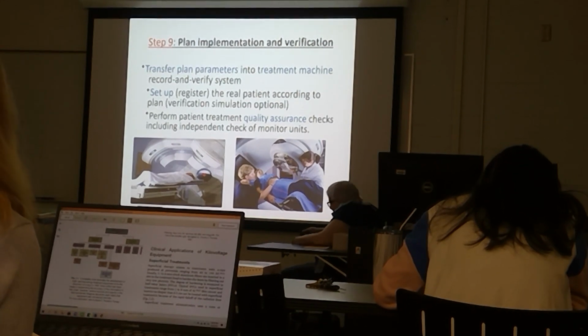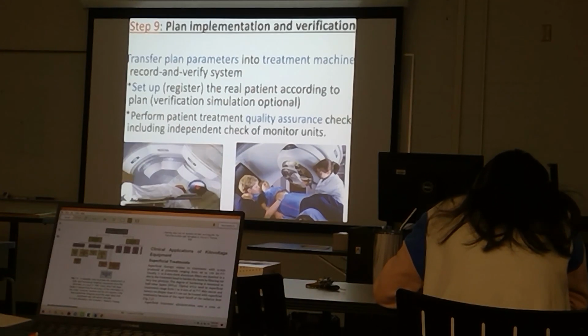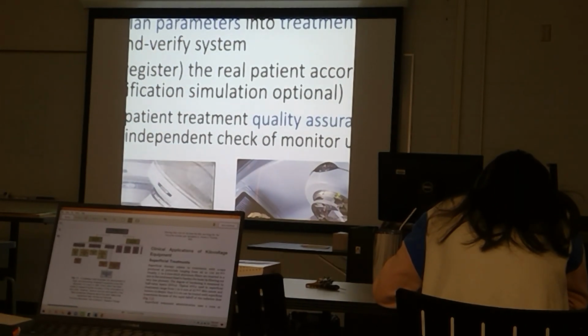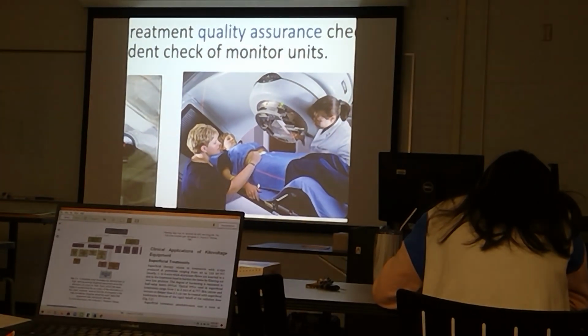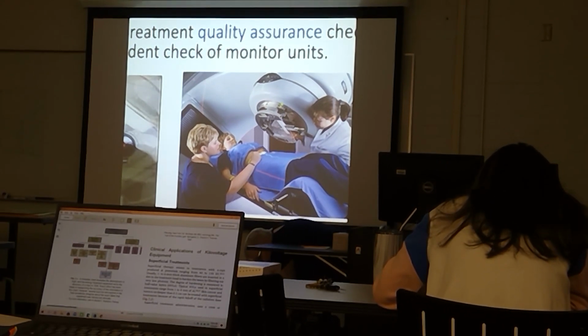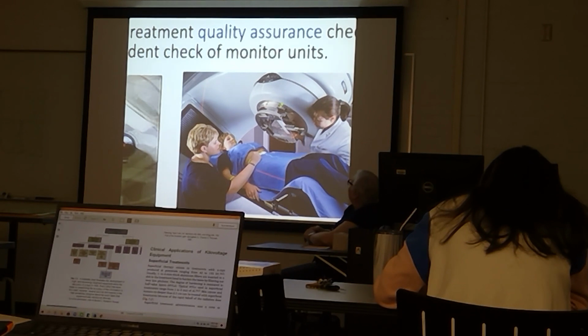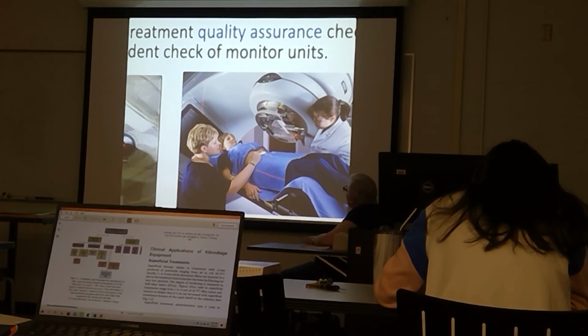You can't see it. Oh, is that a ruler? Yes. So what is she doing? What is she checking? SSD. The SSD. Right. And what's her colleague doing?